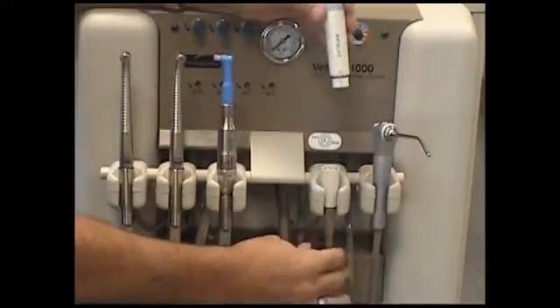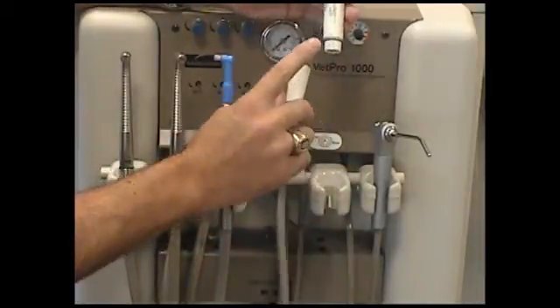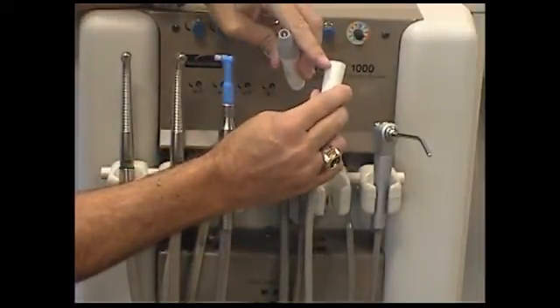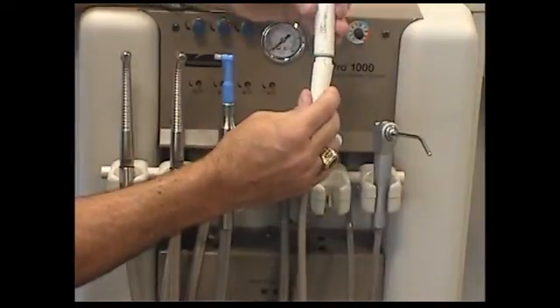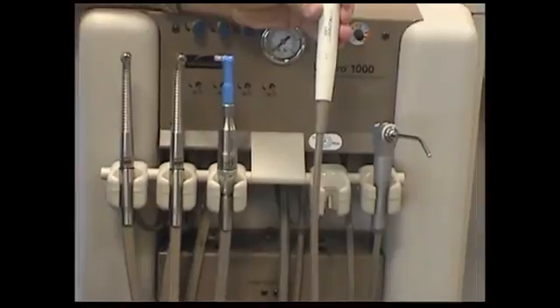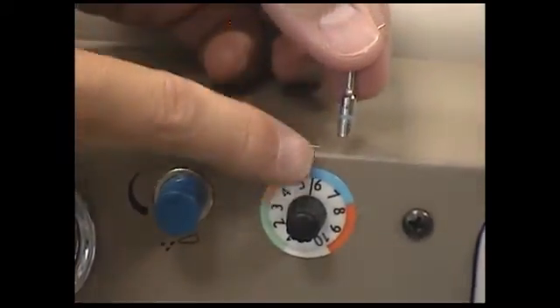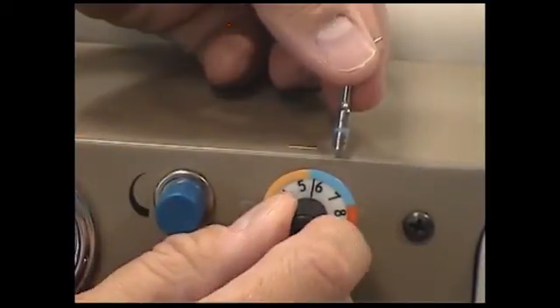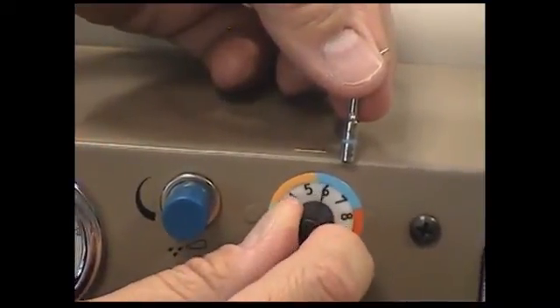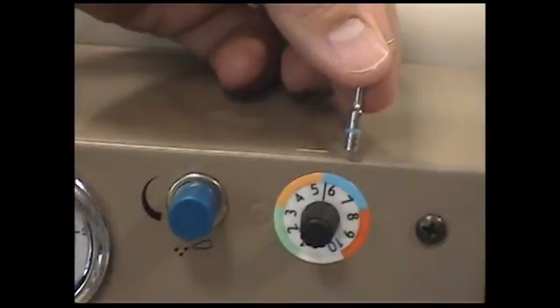Finally, we have the scaler, typically used for removing calculus from teeth. To properly install, match the dots located on the sides of the scaler and the hose. Attach the scaler to the hose as shown. Notice the color bands on the tips available for the scaler — these colors correspond to a range of possible frequencies available for a specific tip on the scaler. Always match the color of the band on the tip with the frequency range band color on the front of the unit.